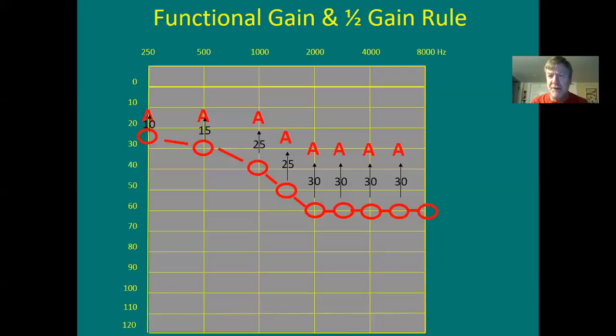You're ripping them off. The people were called hearing aid dealers. Sounds like a drug dealer, okay? Selling hearing aids door to door just about. You fit monaurally, depending on whether the guy was right-handed or left-handed. That's how people used to do it. No kidding. Anyway, you put the hearing aid in his ear. You'd plug his other ear.